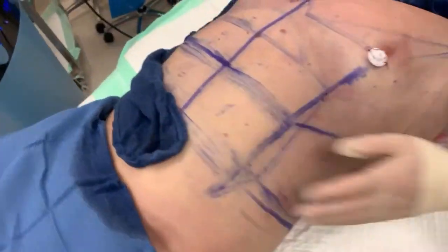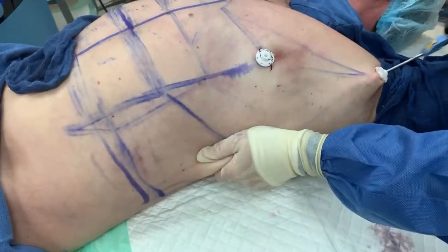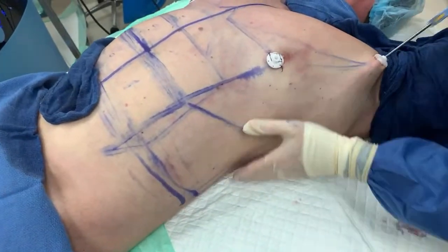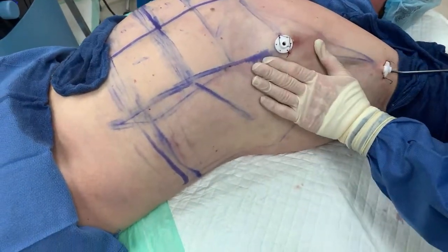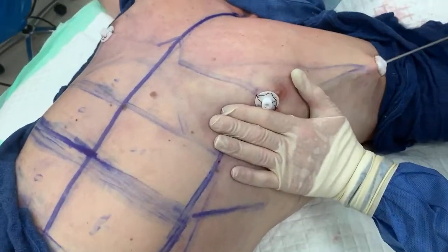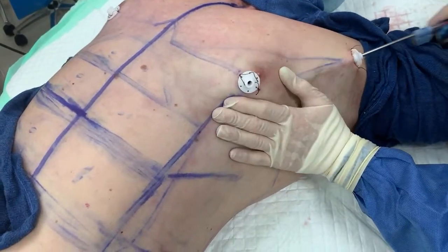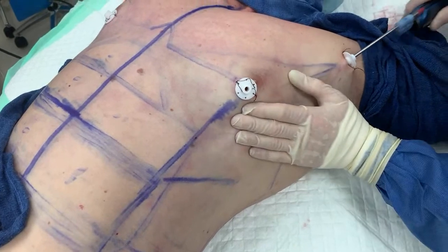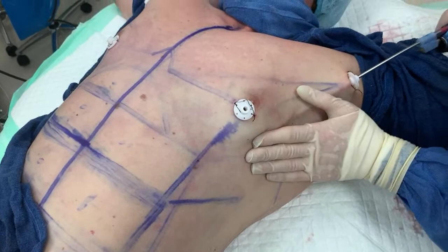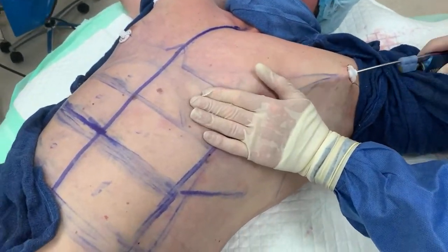Two, two, four, and six — haven't really worked on those yet, but we're doing it. It's a process. Recurrence rate? Zero — with me. I'm going to get this sucker out, hundred percent. I'm the glandulator.